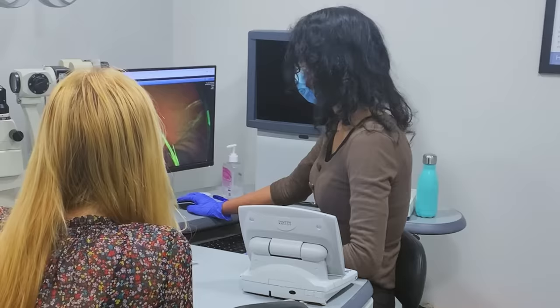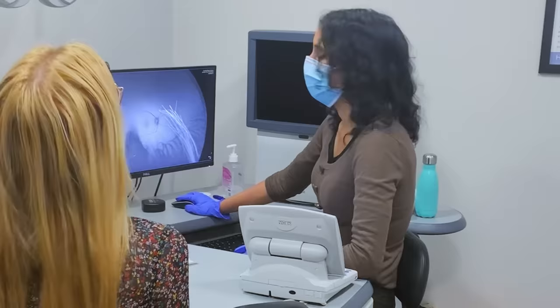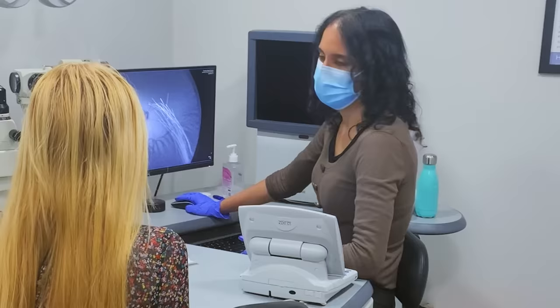It's fascinating. It's a very nice view that we get. That's just a bit of hair there. With this machine, we also get a black and white view, which is very useful because it'll highlight anything that fluoresces easily, like hemorrhages and things. But yours looks great, nice and uniform. Very good.